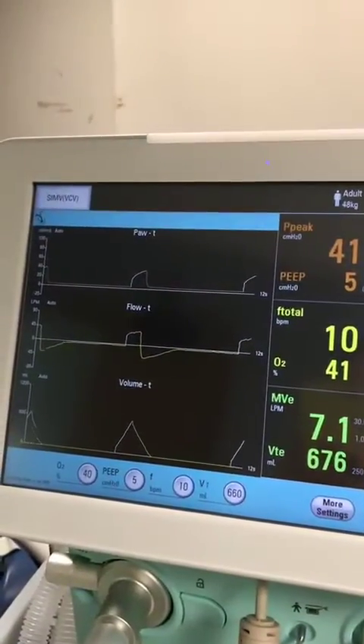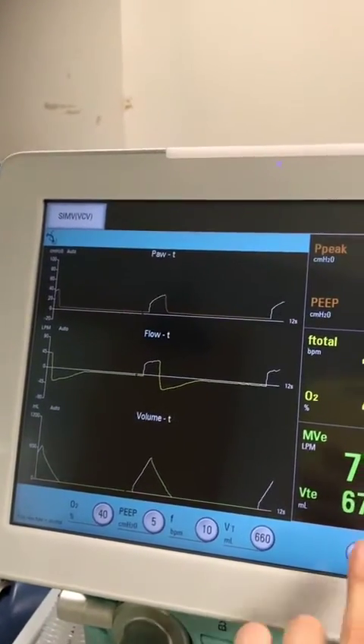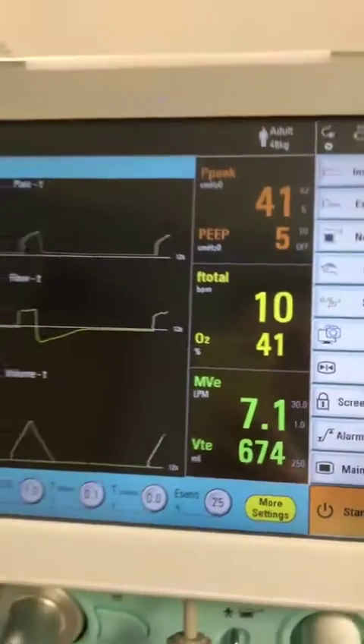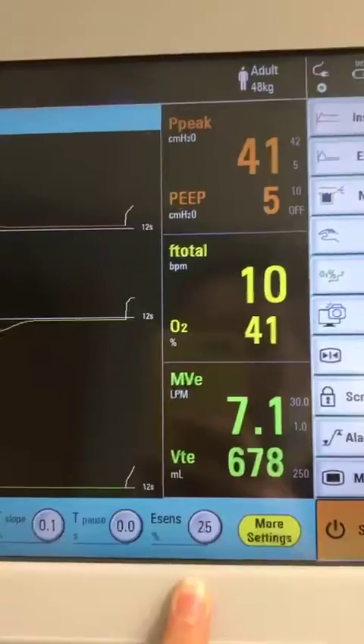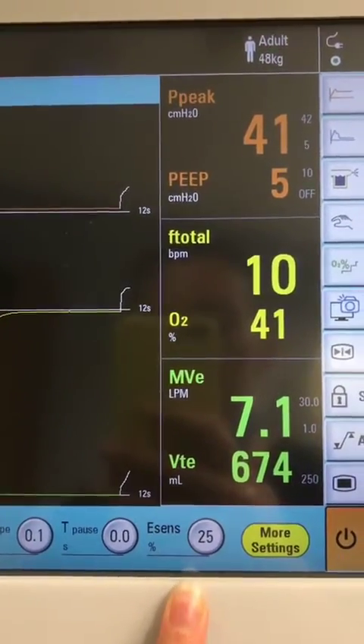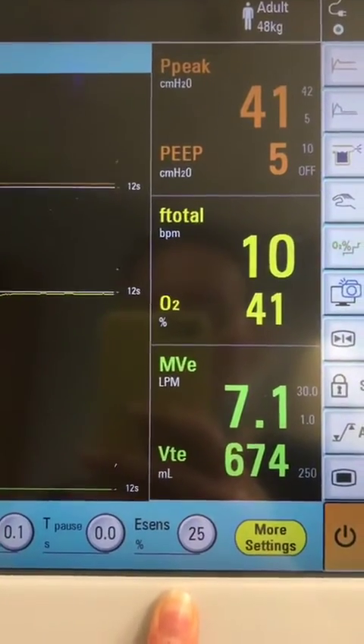In any of the modes that have a spontaneous element to them, you'll find in more settings there will be eSENS, which is the expiratory flow cycle sensor. I've been instructed that 25% is just about right.